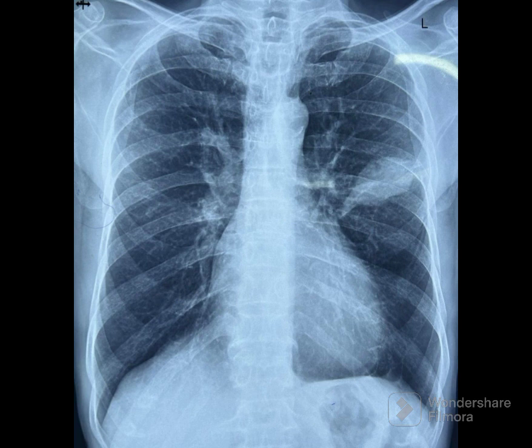Usually, there is significant reduction in size with diuretic therapy and congestive heart failure management. Pseudotumor predominantly occurs in the right hemithorax, with 75% of them in the right horizontal fissure. It is very rare in the left hemithorax.